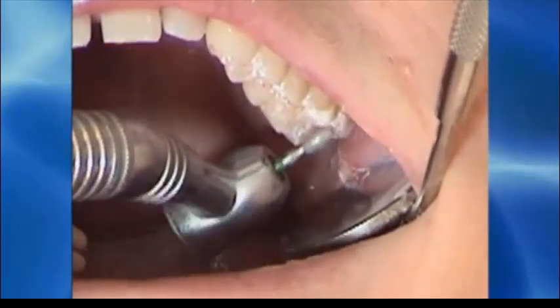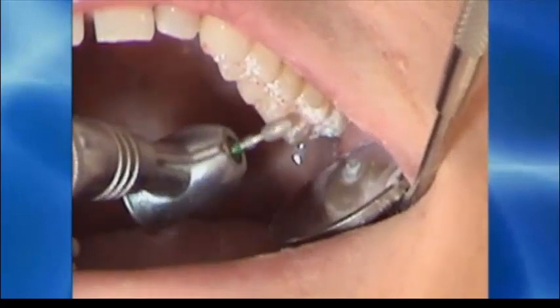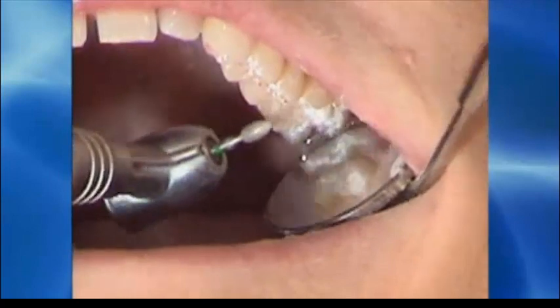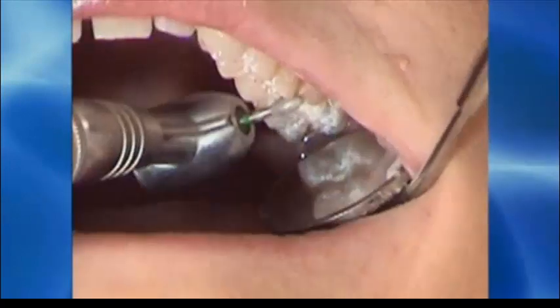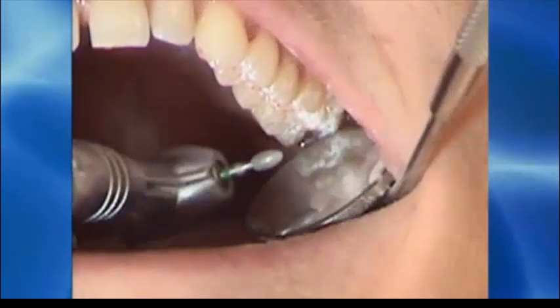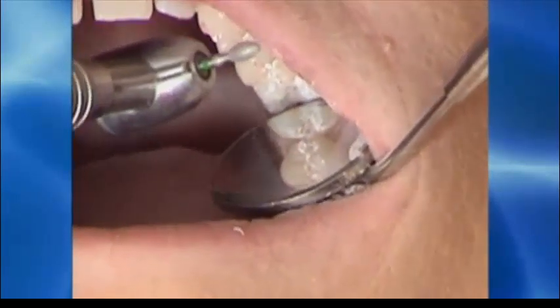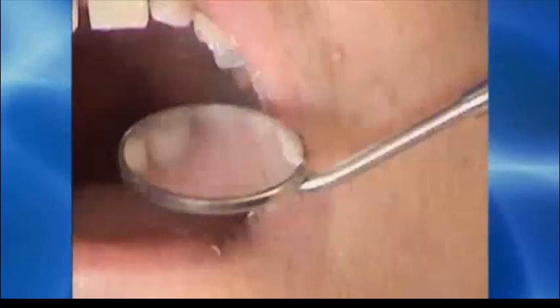That's what I'm doing here. I'm just touching the teeth, removing small lace-like marks that the T-scan shows to be long disclusion time. And for some of you that may be an adjustment in your own thought process, because a lot of the marks that we're treating are very small, lace-like, and scratch-like.